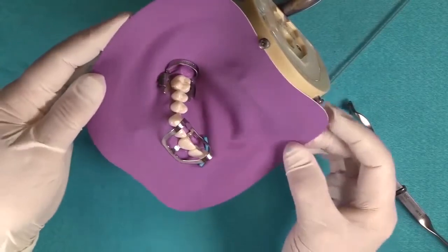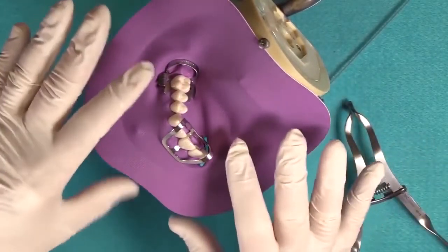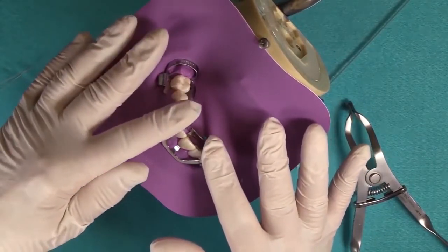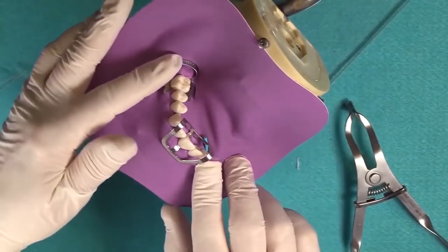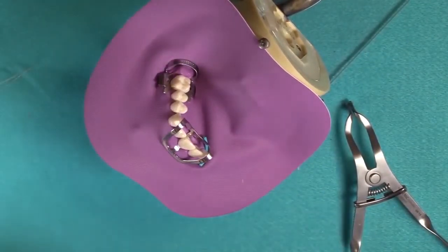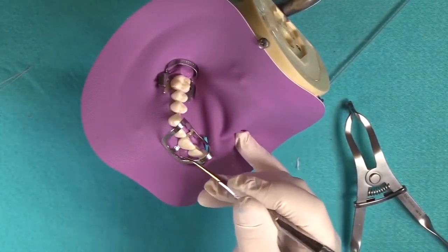Now, again, I'm not sure if all the dental schools still teach that technique, but you can see why you wouldn't want to use this as a retaining clamp, because it's just not sufficient enough to do that. But in combination with the wedge, right, we have the wedget on this end, and we have the clamp on that end, so we're fine. So anyway, at this point, the doctor would go ahead and prep the tooth.